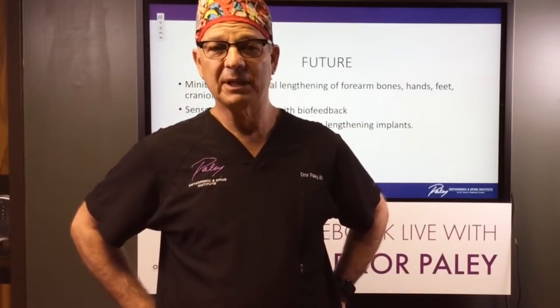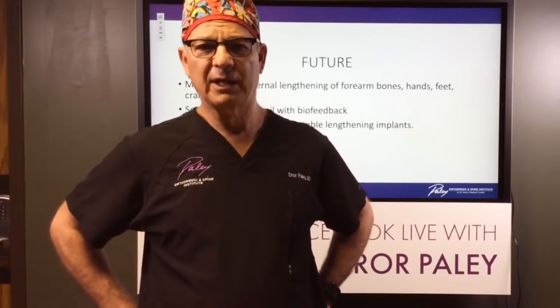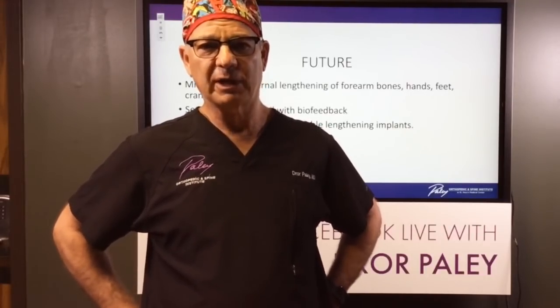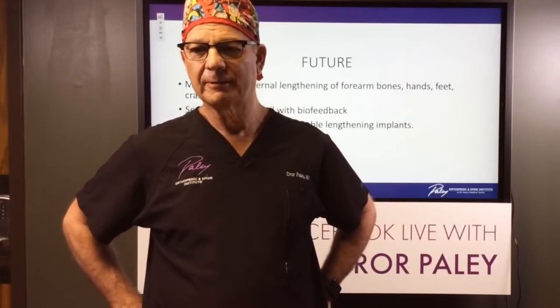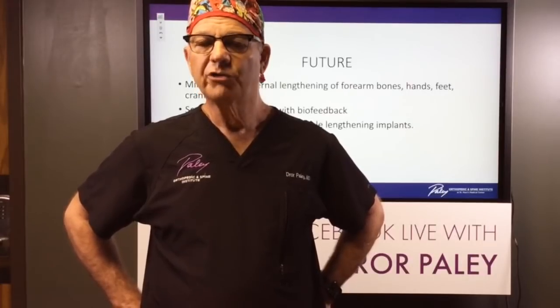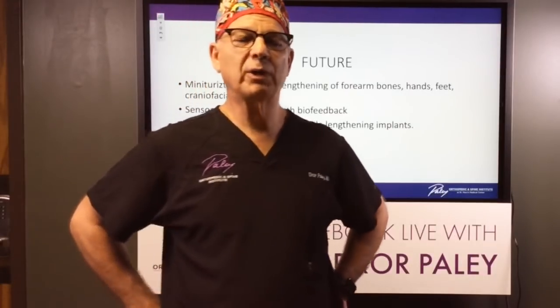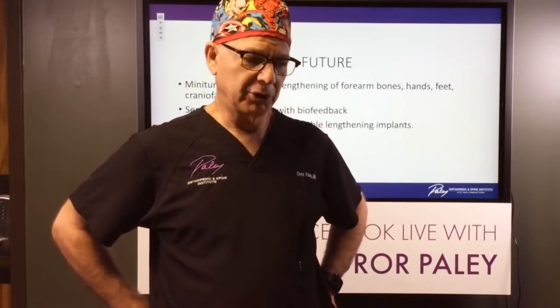The external fixator can. So then you have to do the arm lengthening twice. If you're willing to do it twice, and we have done that. We have several patients that we've done two 5-centimeter lengthenings. Then it can currently be done. The plate has never been used on the arm, but I'm sure it will be.